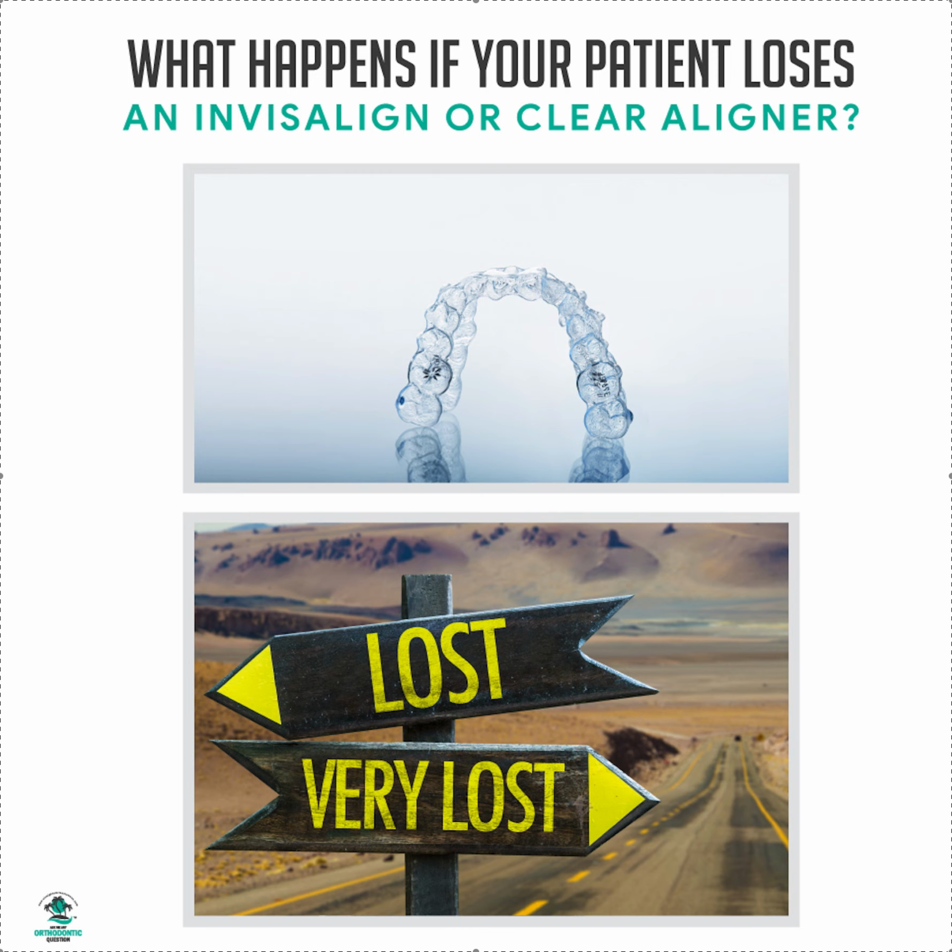You can't do two things at one time. So if you're currently ordering the replacement aligners, you won't have to take a new scan for that. They're just going to literally make the ones that were in the plan, assuming that they're fitting. Now, if you're trying on 19 and 21 and they're both way off, well, in that case, I think it's better just to hold and do a refinement. That's what I would do. I would just hold in whatever one is least annoying, unless you want to make an in-house retainer, and stop and just do a refinement.